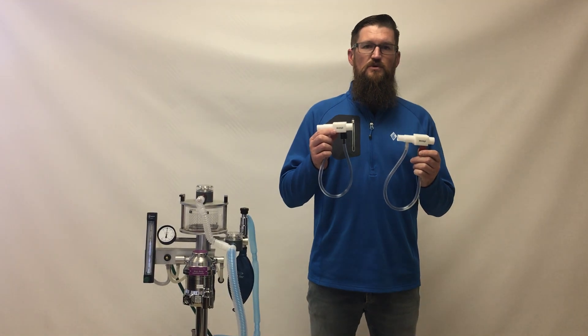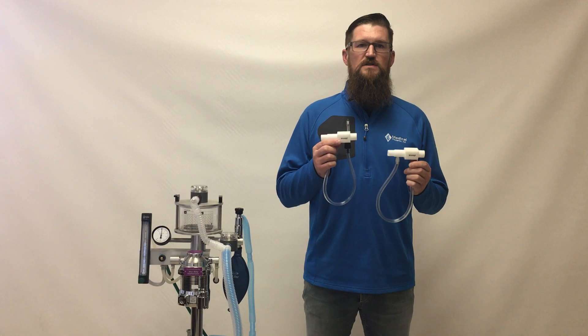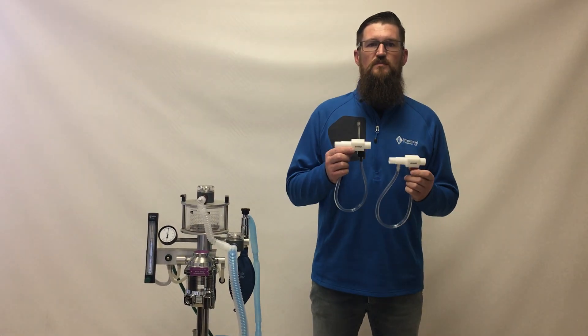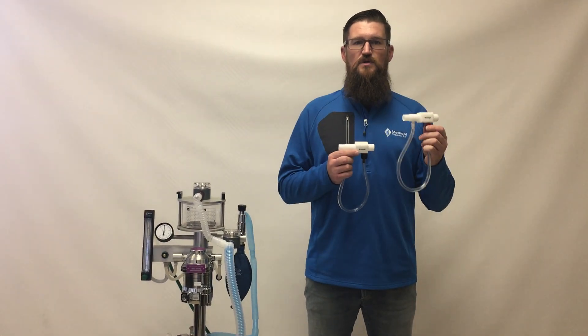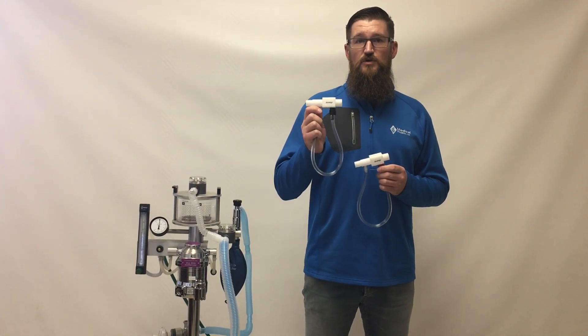The Safety 30 is for use generally where ventilators are used a lot, or if there's any specific need to go a little bit higher than 20 centimeters of water pressure. By far the most common is the JDM Safety 20 for general use.